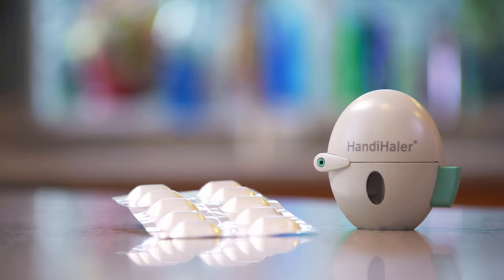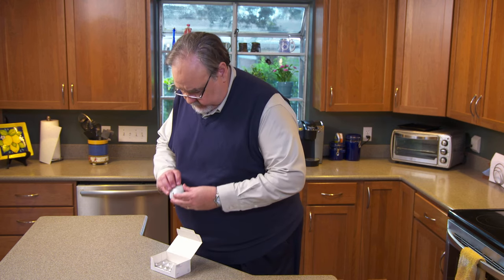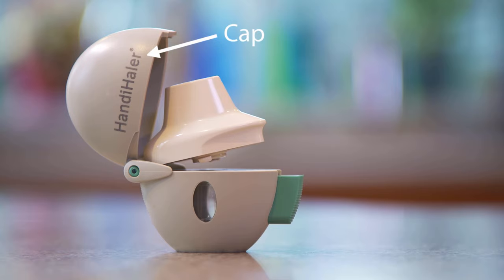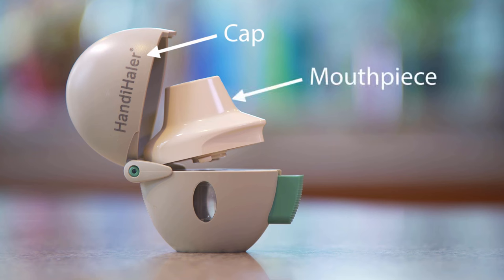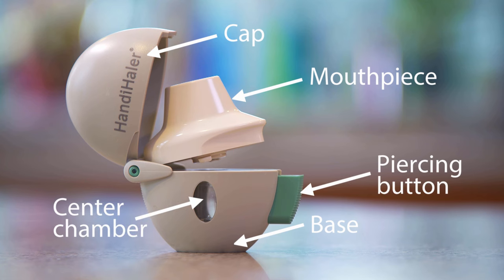When you get your HandiHaler, check the expiration date to make sure the medicine isn't expired. The HandiHaler comes in one piece. There's a cap that protects the HandiHaler from dust or lint, the mouthpiece that the medicine comes out of, the base, the center chamber, and the piercing button, which is green.